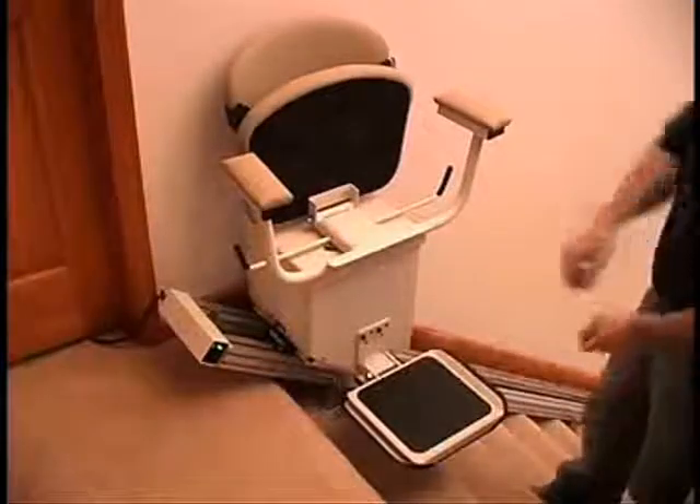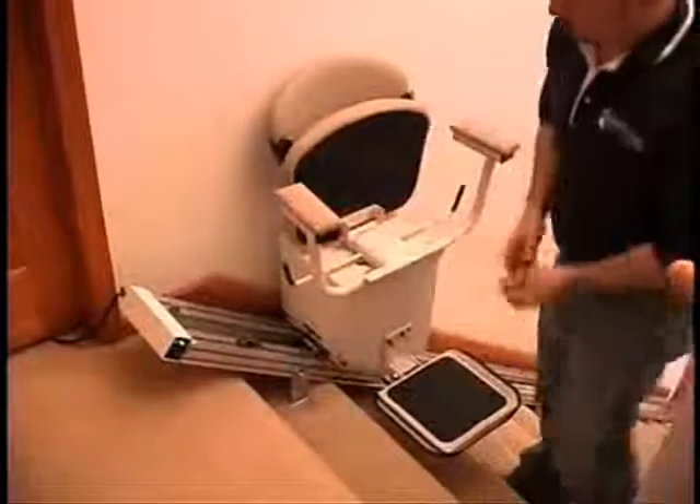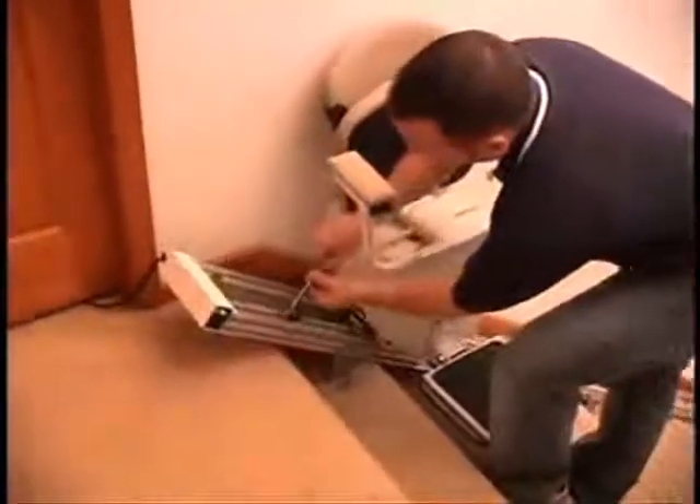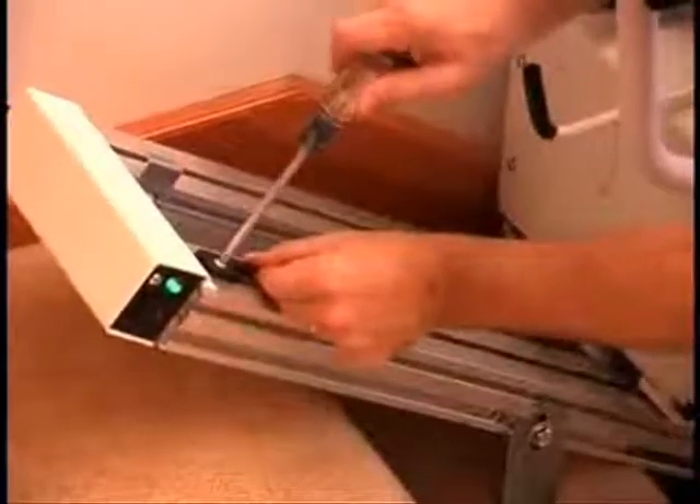Now it's time to set the upper limit cam. First, lower the unit about a foot using the control switch on the armrest. Then, loosen the cam, slide it up against the upper track cover, and tighten.